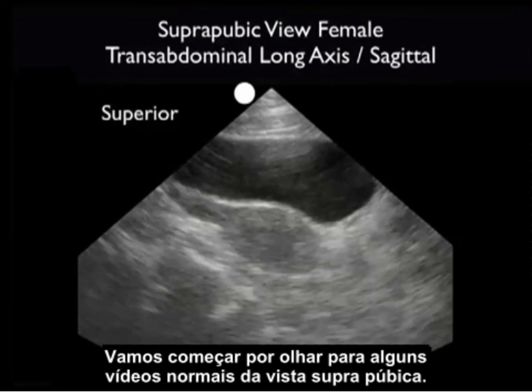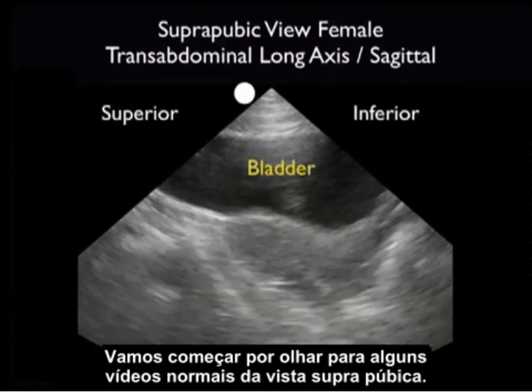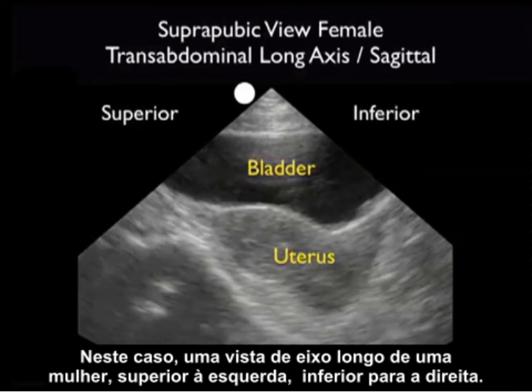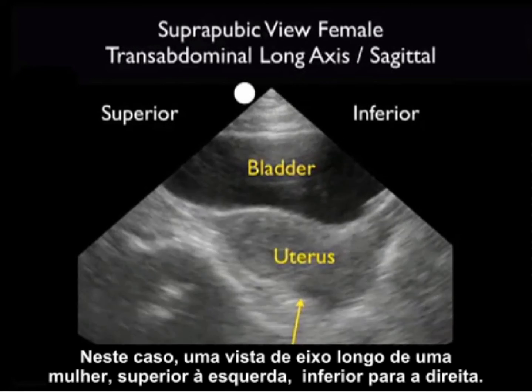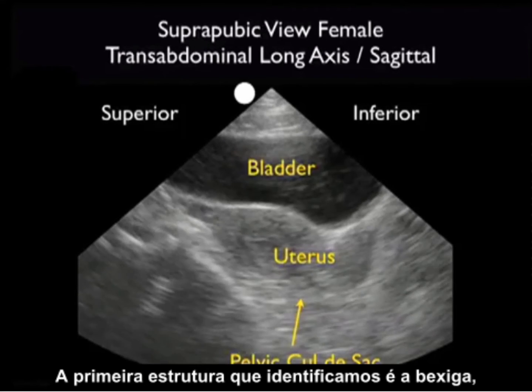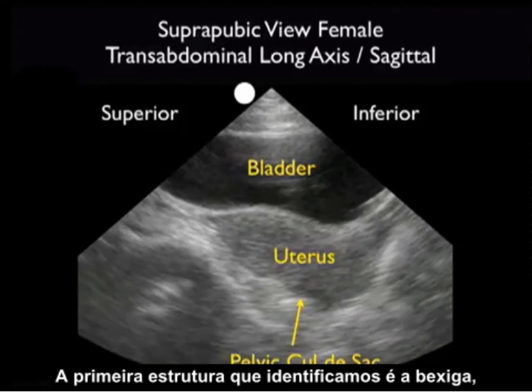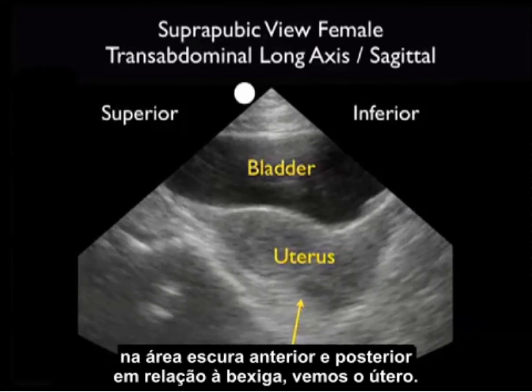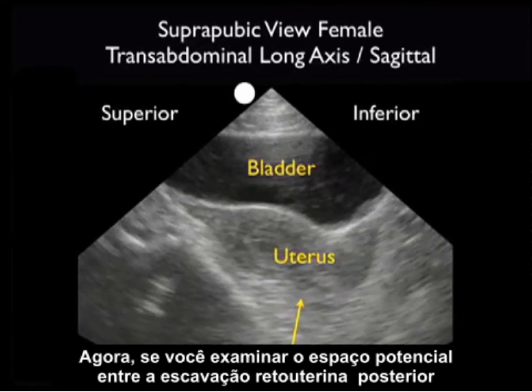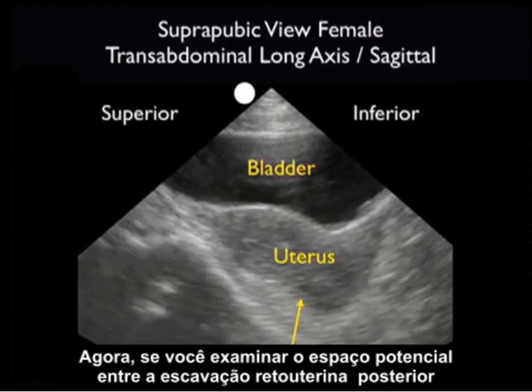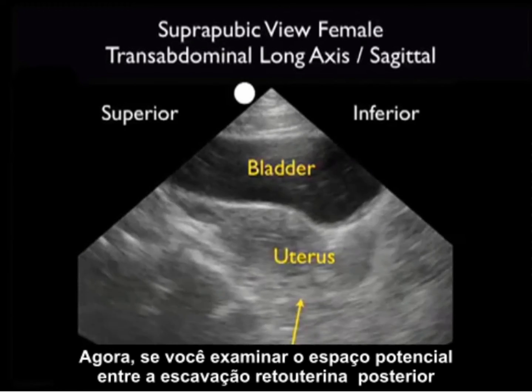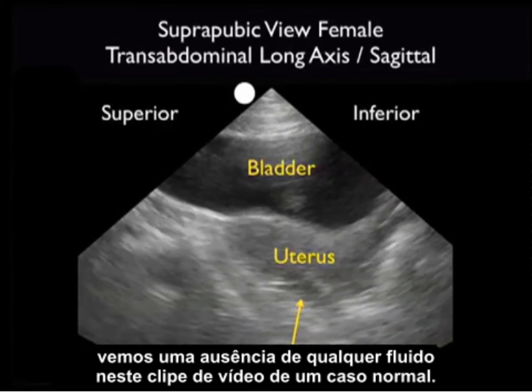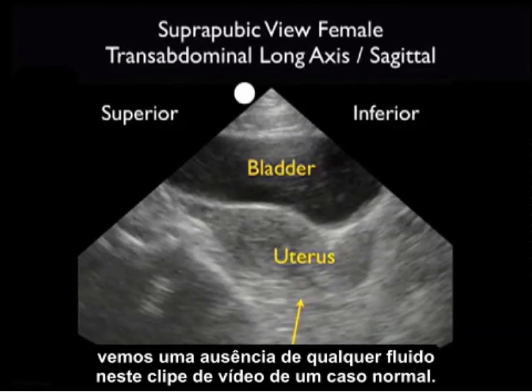Let's begin by looking at some normal video from the suprapubic view — in this case a long axis view in a female, with superior to the left and inferior to the right. The first structure we identify is the bladder, the dark area anteriorly, and posterior to the bladder we see the uterus. Now if we look into the potential space — the pelvic cul-de-sac posterior to the uterus — for any dark fluid collections, we see an absence of any fluid on this normal video clip.